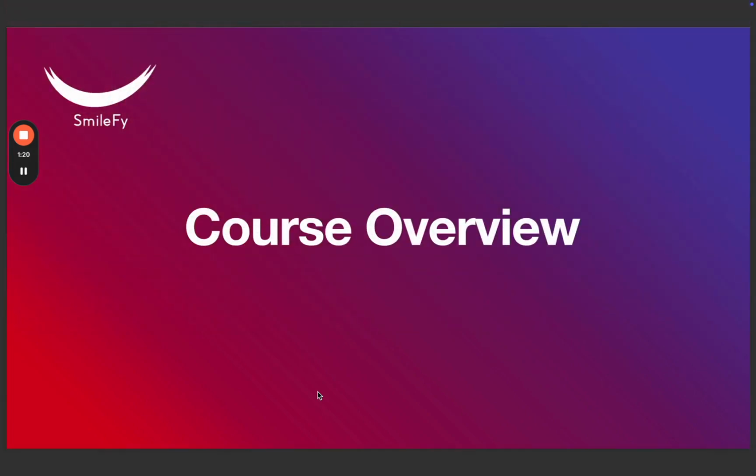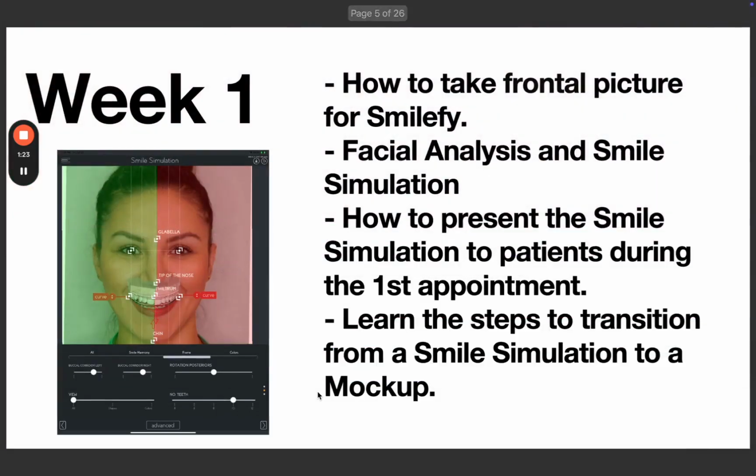So let's start with the course overview. We are going to have 3 weeks available for you to learn the SmileFy software. During the first week, you will be learning how to take the proper frontal picture for your patient, how to design smile simulations using the facial analysis, how to present the smile simulation to your patients during the first appointment, and learn the steps to transition from a smile simulation to a mock-up design.